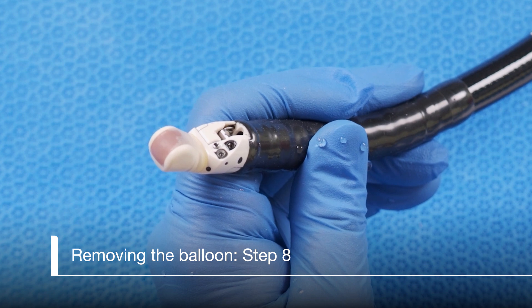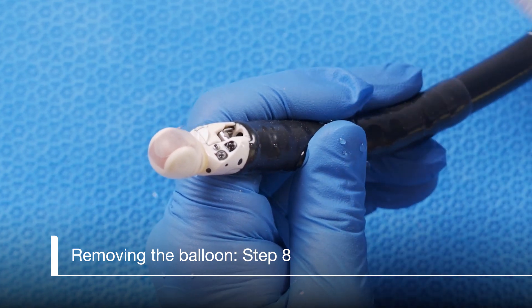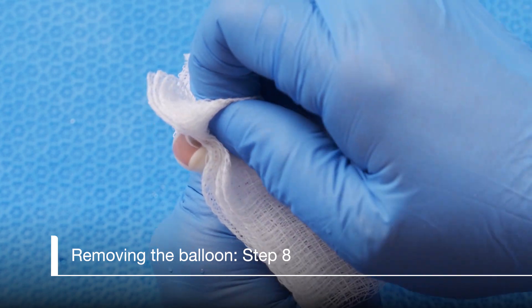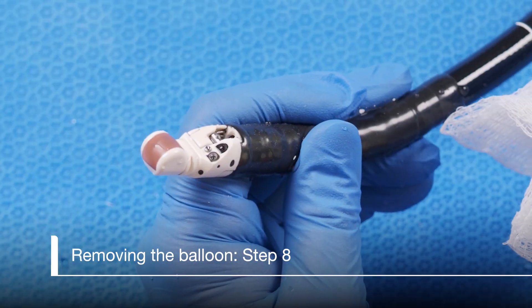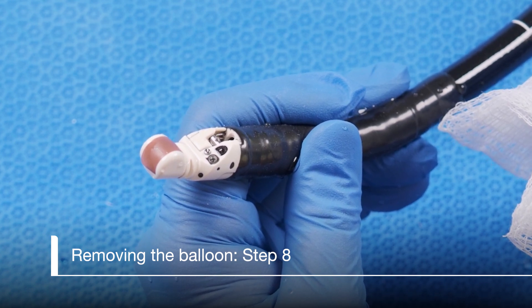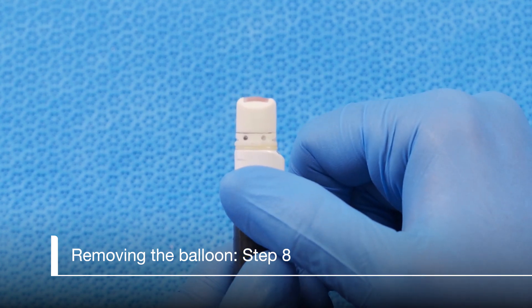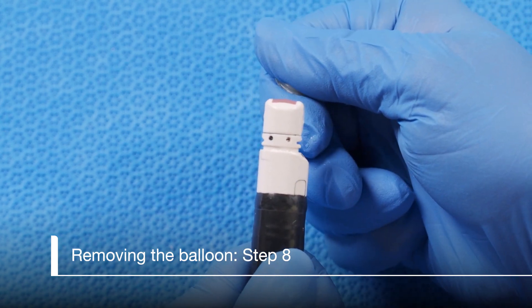Next, let's talk about removing the balloon at the end of the case. Inflating the balloon with water slightly will make this easier. Holding the end of the scope securely, cover the balloon with a 4x4 to prevent splashing. Pinch the balloon and quickly remove from the tip of the scope and discard. Do not pinch or pull the scope, only the balloon. Alternative method: while holding the end of the scope securely, place thumb at the base of the balloon on the back of the transducer and roll the balloon off.